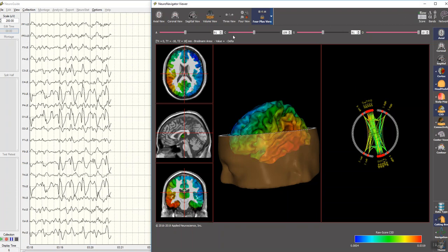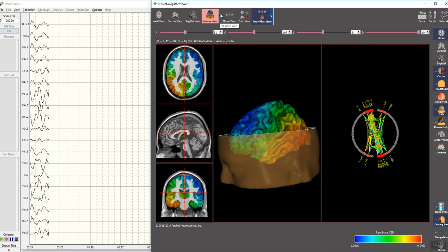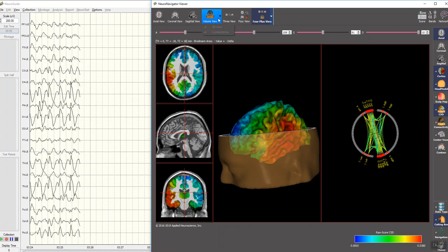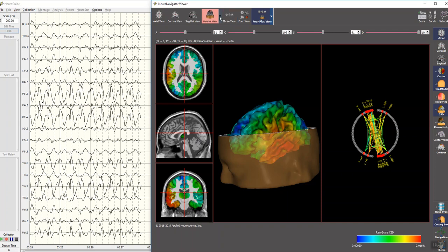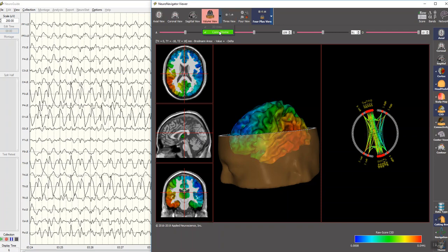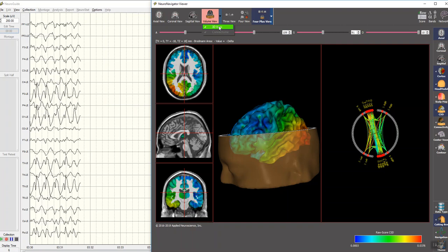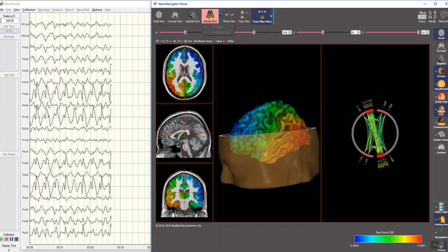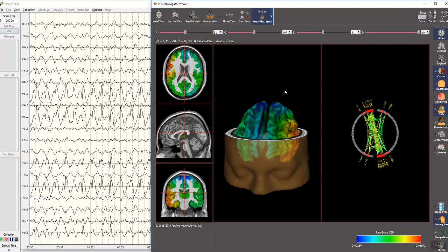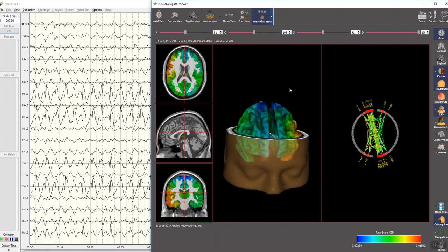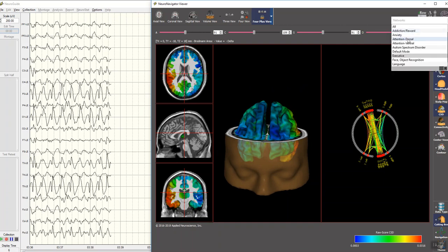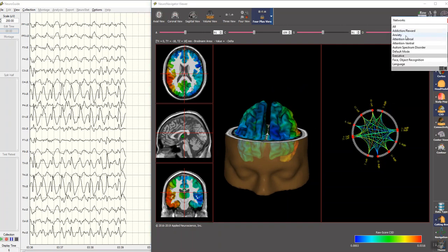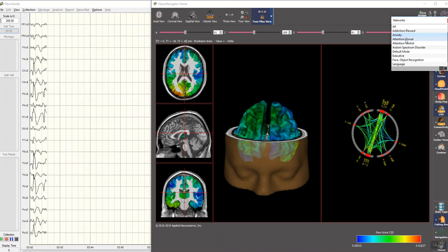We can look just at the connectome and nothing else if we wish, and we can change the networks. So here's the anxiety network, for example, the attention dorsal network.